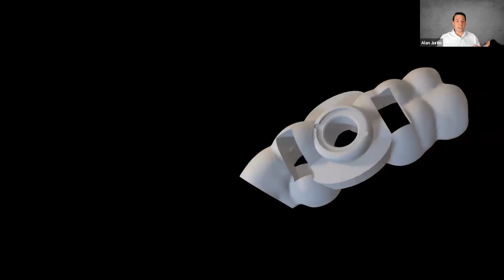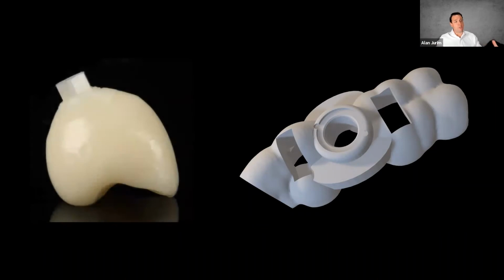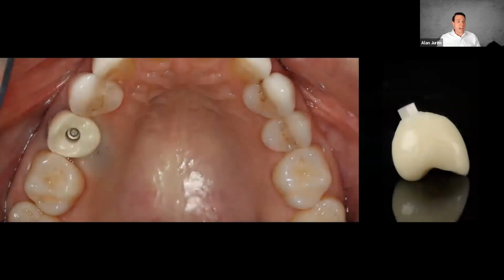And this design of our surgical guide also allows us to have some other benefits, like we can produce an immediate restoration before the implant's placed, after the implant's placed, but it allows us to understand the complexity of the surgery and then to transfer that from the screen back into the patient's jaw.